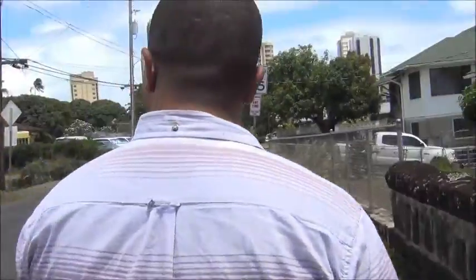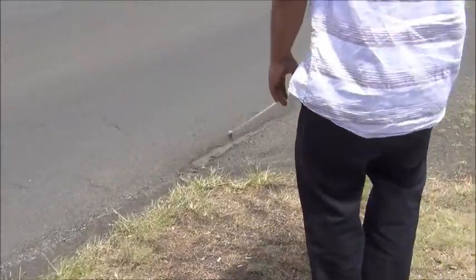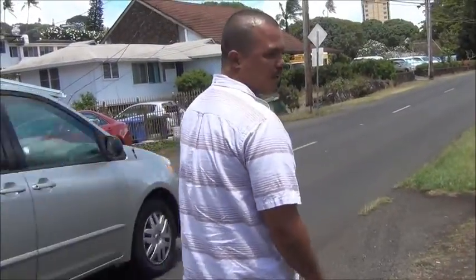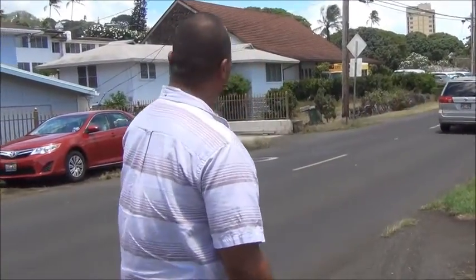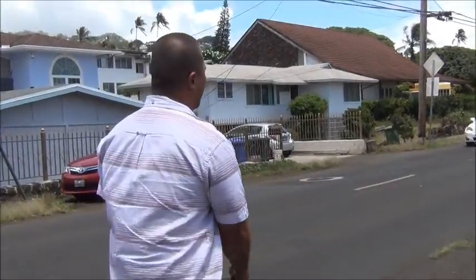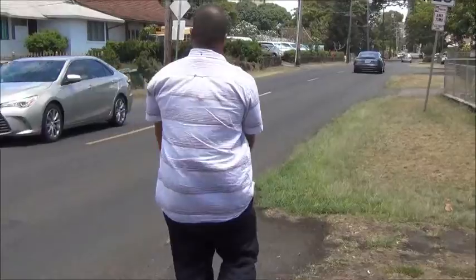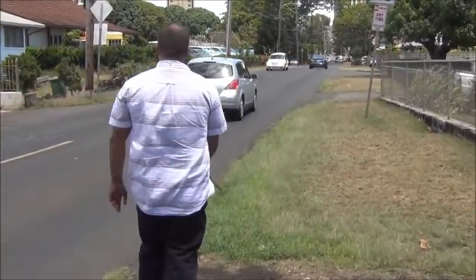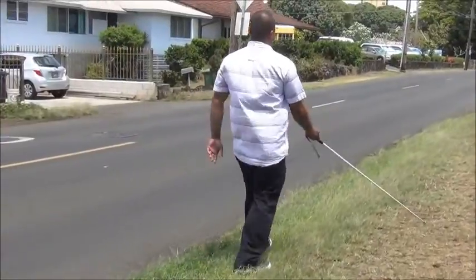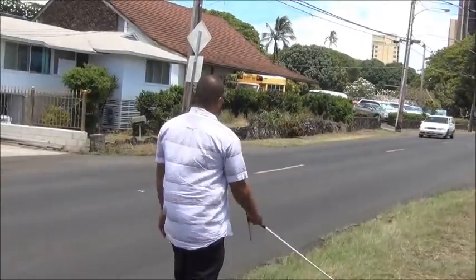So what I do first is, I'll make sure, okay, street to my left, find the street. Okay, I found the street, so pay attention to the traffic flow. I'm gonna freak that car out a little bit, he slowed down. Okay, so I hear which direction the car is going, I'll head in that same direction. Always make sure that the traffic is to my left, the street is to my left.